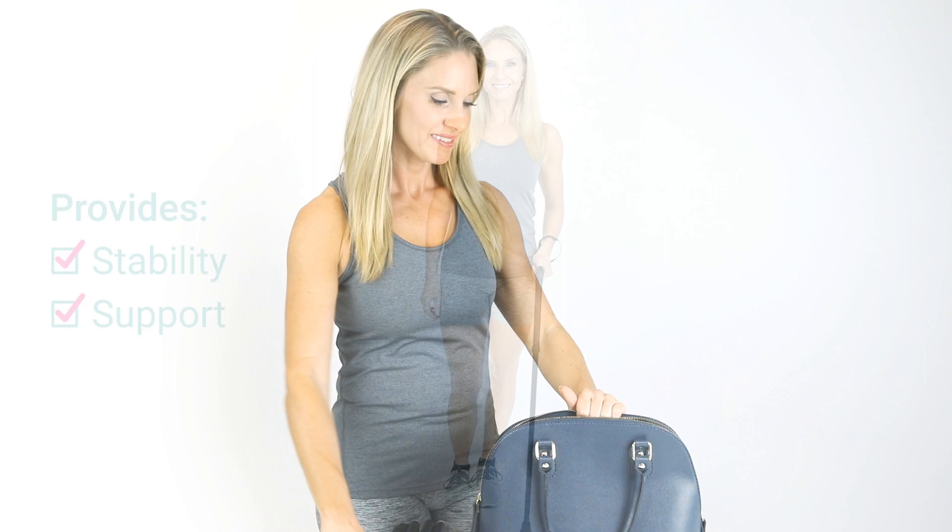The folding cane by VIVE provides the perfect combination of stability and support while walking on any surface. Folding at three points, the collapsible cane is compact, easily fitting into your bag.